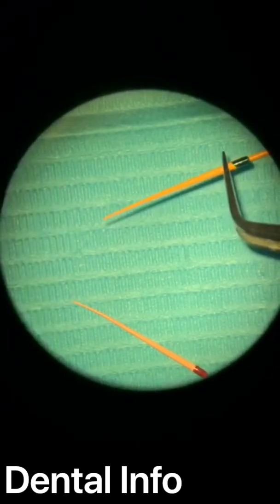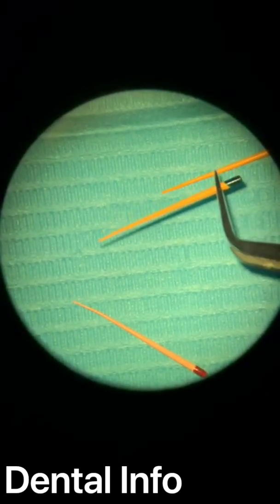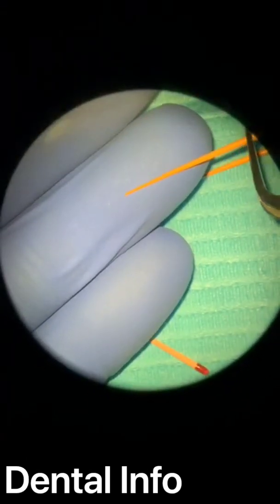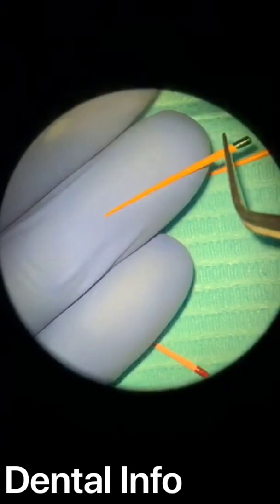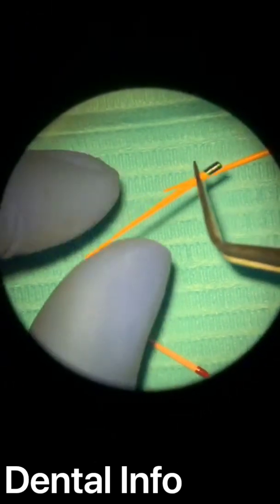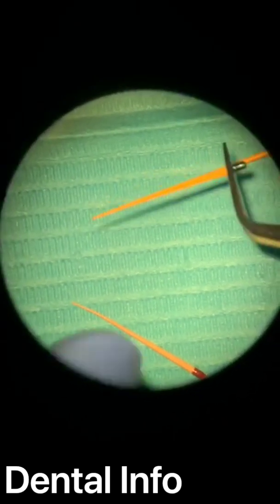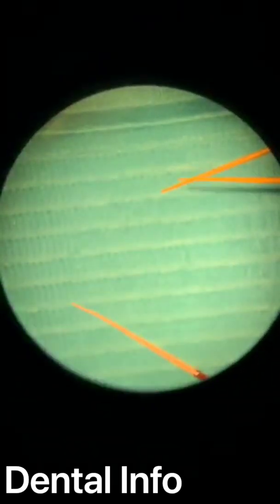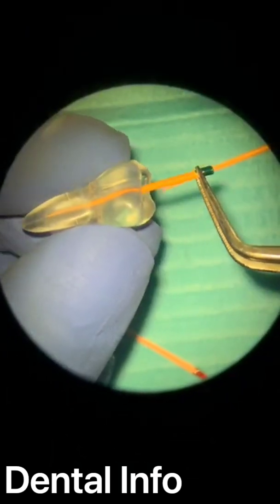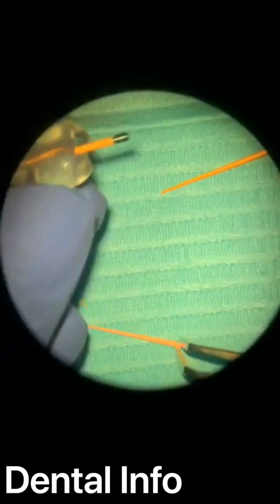Cut it with a blade on the glass slab, because you will have a very fine and very clean cut. So nail clipper, you can put nail clipper in your clinic just for cones, and you can clip the tip with nail clipper or with sharp blade on glass slab. So you will have a very clean cut. But in my case here, I don't want to modify the tip because I'm very happy with my tugback.